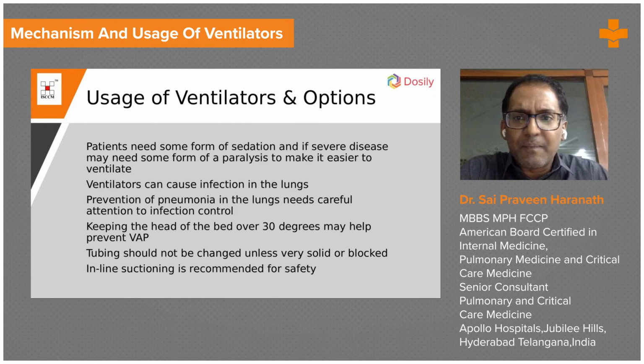Many patients need sedation because they will not find it comfortable to breathe. And sometimes you even have to paralyze these patients so they are completely not able to move. Ventilators can be dangerous. They can cause infection, and you have to be very cautious about infection control, like washing your hands, covering your mouth, not touching your face. When you're doing suction, keeping it closed.